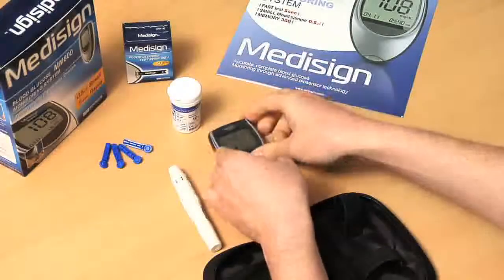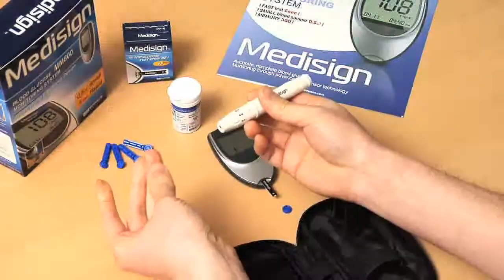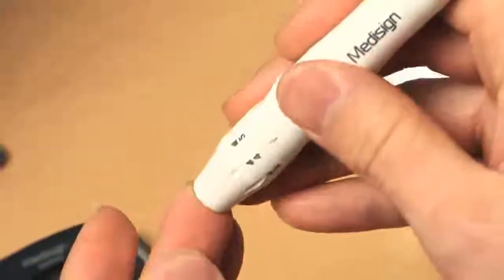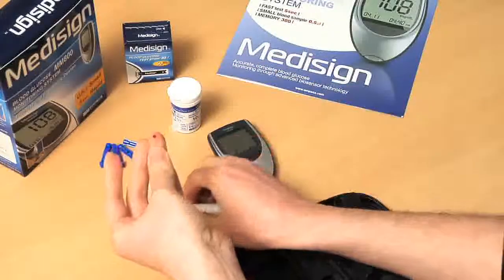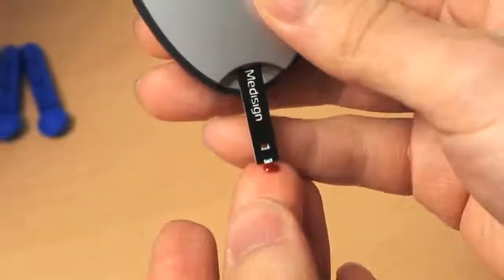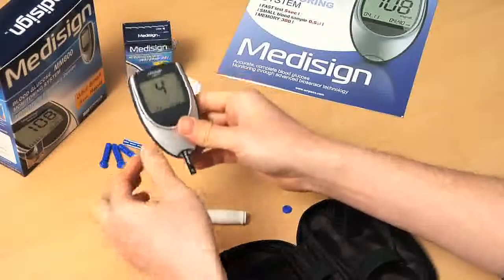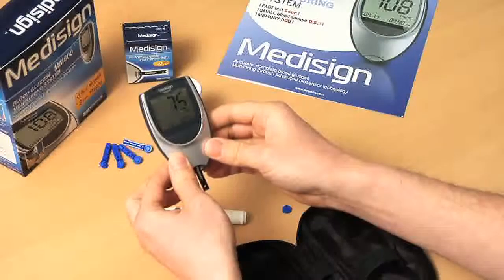Rest the cap on your finger. Press the release button to take a blood sample. Gently squeeze your fingertip until a drop of blood forms on your fingertip. Put the blood drop on the sample channel at the end of the strip. After five seconds, the result of the blood test will appear.